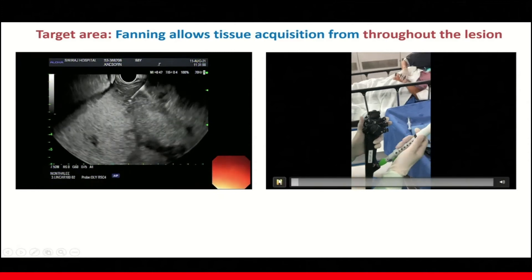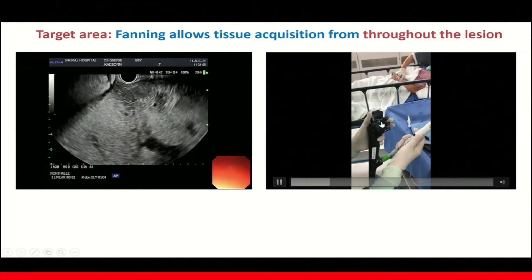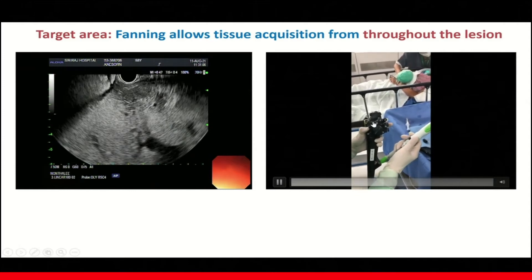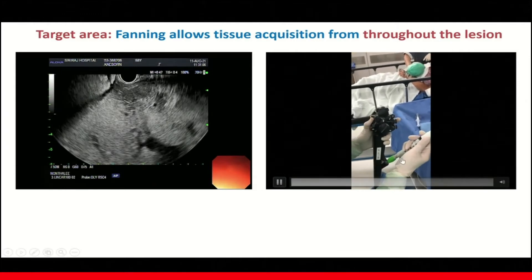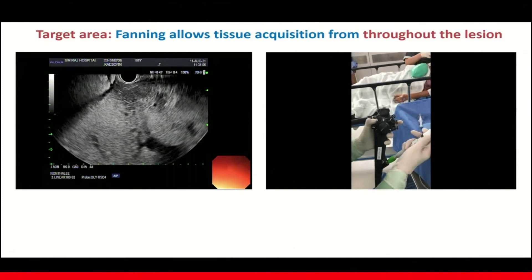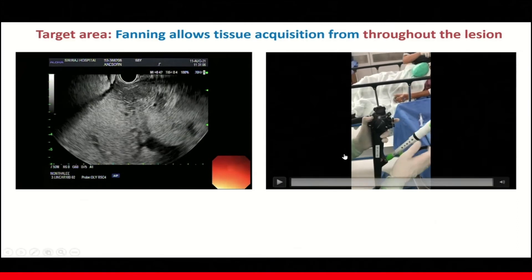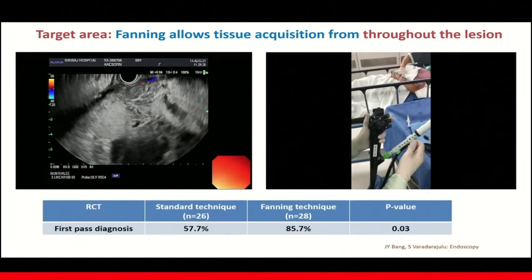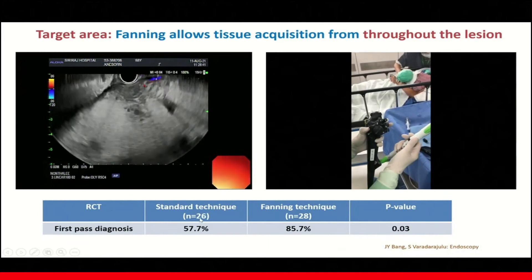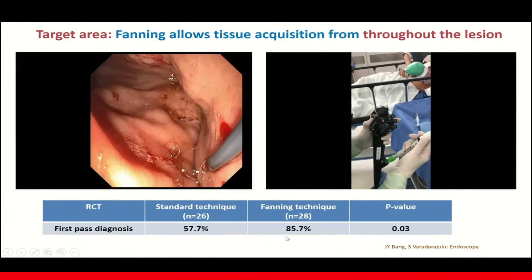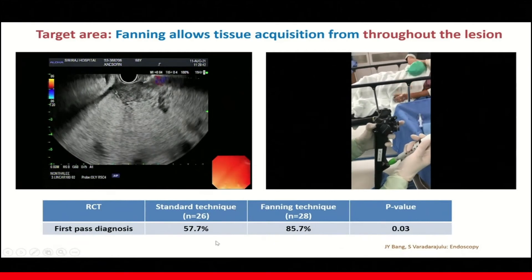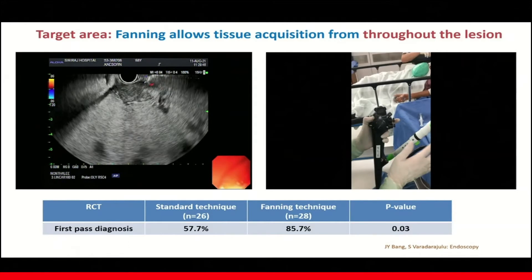To achieve this technique, you can do it by controlling the big wheel in order to bring the needle up and down, or you can use the elevator as well to direct the needle trajectories. However, I would avoid using too much of the elevator because it may bend your needle. A randomized controlled trial demonstrated that with the fanning technique, it provides better first-pass diagnosis compared to standard technique without needle dysfunction — 85.7% versus 57%.